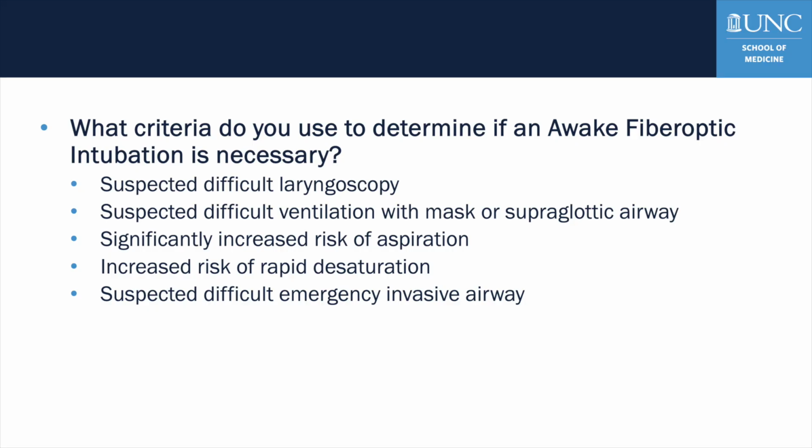Based on the ASA difficult airway algorithm, consider an awake fiberoptic intubation when you identify any of the following. 1. Suspected difficult laryngoscopy. 2. Suspected difficult ventilation with mask or supraglottic airway. 3. Significantly increased risk of aspiration. 4. Increased risk of rapid desaturation. Or 5. Suspected difficult emergency invasive airway. All of these may include patients with distorted anatomy from tumors, prior radiation, infection, or trauma. When any of these criteria are present, awake fiberoptic intubation allows you to maintain spontaneous ventilation, airway reflexes, and secure the airway before induction.